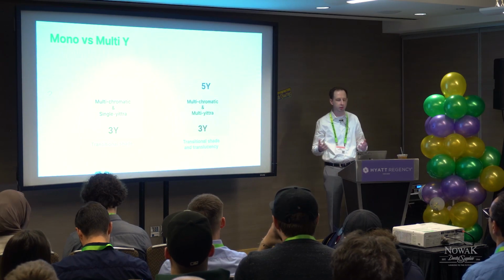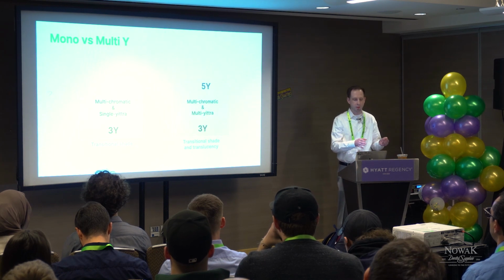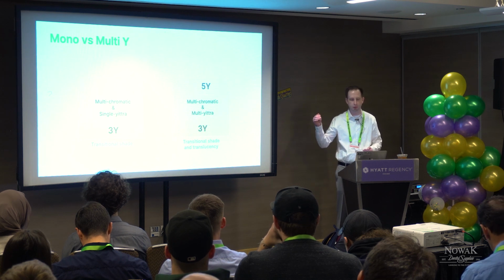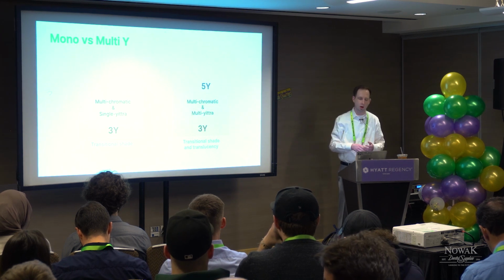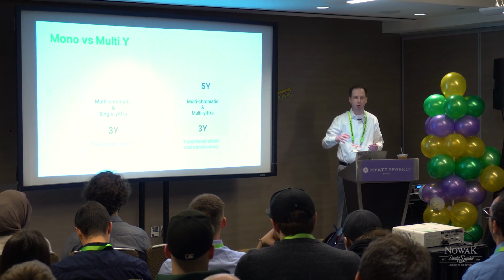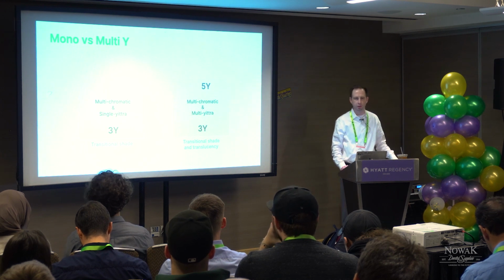those translucency ranges. And then pretty recently, we've been seeing a lot of multi-yttria. So there's multichromatic or multi-layered single yttria materials in the market that could be a 3Y, 4Y, or 5Y, but now there's transitional color and transitional yttria. So it goes from incisal, from a 4 or 5Y, down to a cervical of a 3Y. So you get the translucency on the incisals and your strength around the margin of the restoration and your opacity, maybe blocking out a dark stump.